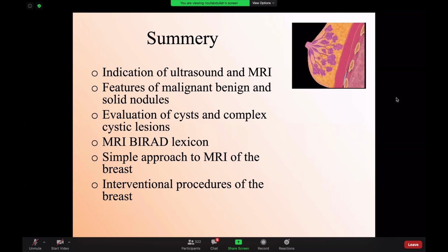You learned about the core biopsy. What is the size of the core biopsy? It is 14 gauge. You learned when to use ultrasound for biopsy. You learned about what is the indication of vacuum-assisted biopsy. What is the size of the vacuum-assisted biopsy needle? It's usually ranging from 9 to 12 or 13. We always put a marker post-biopsy, and then you learned as well, when do we use MRI-guided biopsy? Whenever we have a lesion that is visualized only on MR and not seen on anything else.